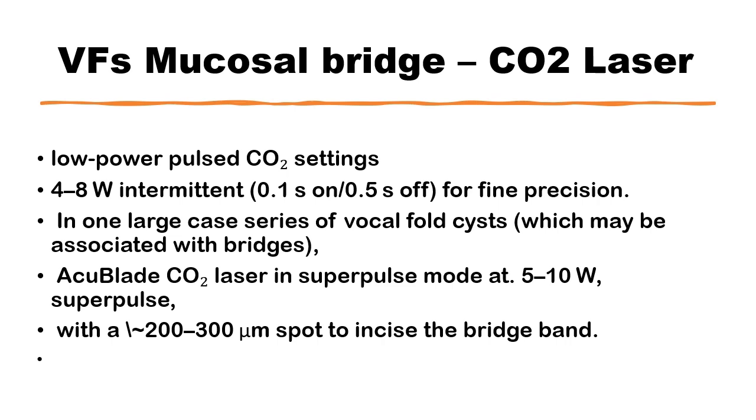The carbon dioxide laser settings, if that's used in the resection of the mucosal bridge, should be low power and pulse. It can be somewhere between 4 and 8 watts. Other surgeons have used a bit higher power, but the pulse should be about 100 milliseconds on and 500 milliseconds off. And the usual is that you would have the focus as a spot about 200 to 300 micrometer spot to incise the bridge band epithelium.